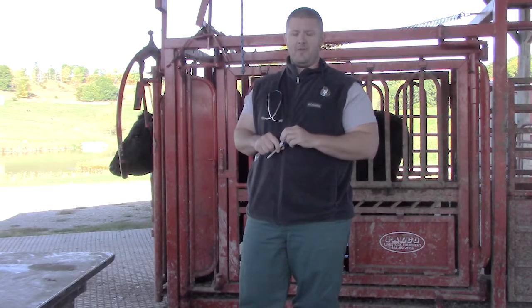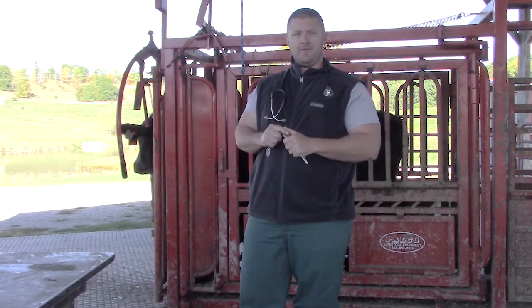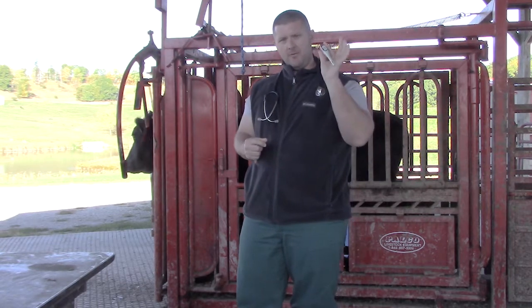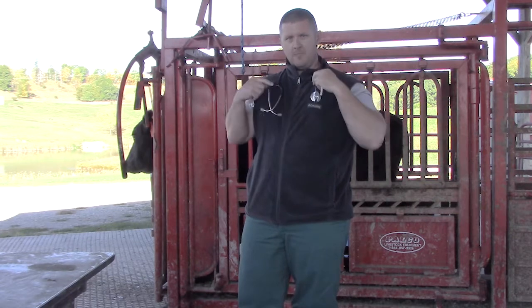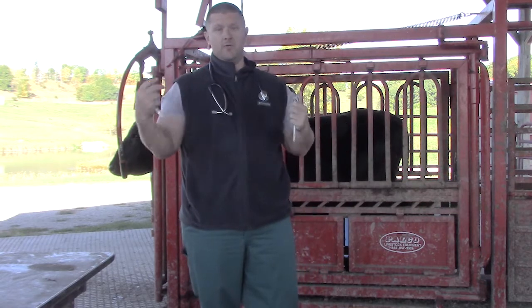I'm Justin Kiefer, the Clinical Veterinarian for the Department of Animal Sciences, and I'm here to talk to you about a physical exam you can perform on your cows. I can train any producer how to do a physical exam with just a few simple tools: my thermometer, my stethoscope, and a rectal sleeve. With that information and what we know about cattle health, we can gather a lot of information on what's going wrong with the cow.